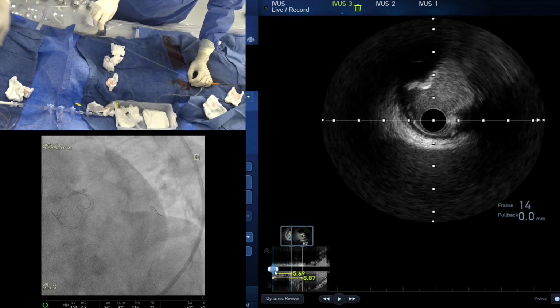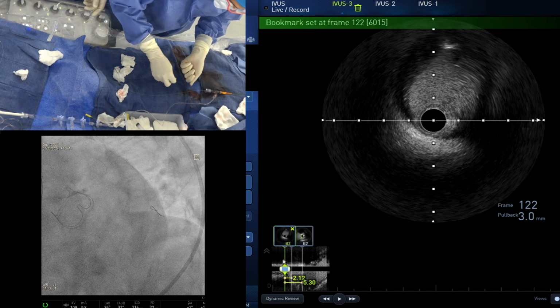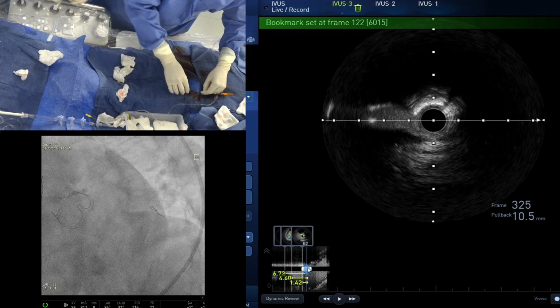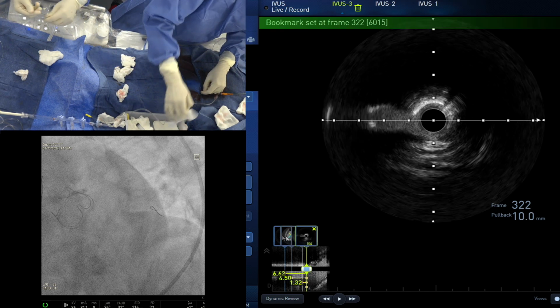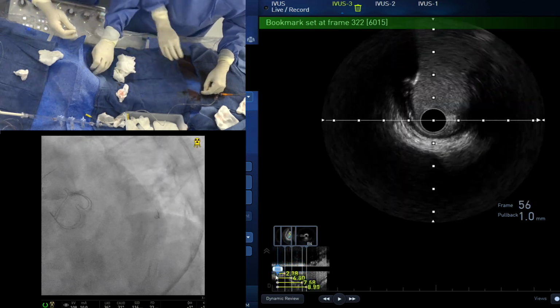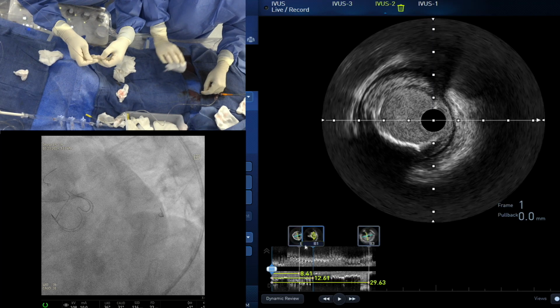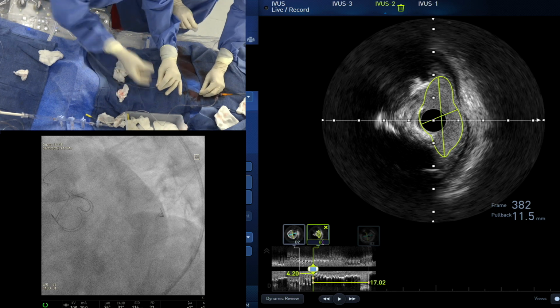Now, more questions will come, and that's where we need everybody's opinion. We want to come out with one stent, if possible, in this case because of baseline thrombocytopenia, and not put in two stents. Otherwise, it's an ideal case for a two-stent approach. So in that situation, should we put a stent from the left main to circumflex and optimize the LAD result with balloon angioplasty only, knowing that we don't have a drug-coated balloon?